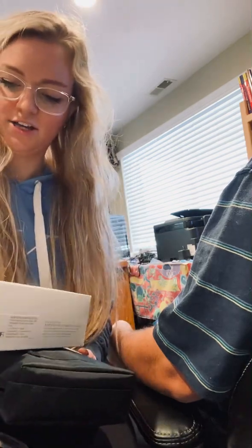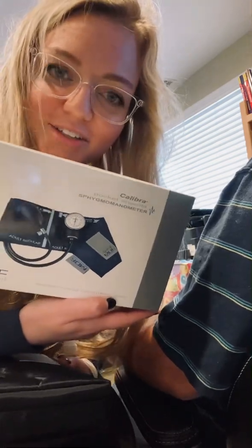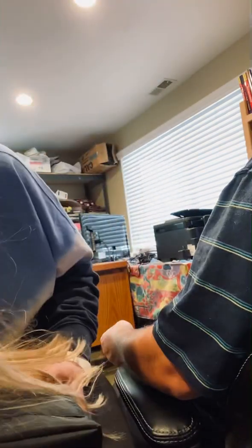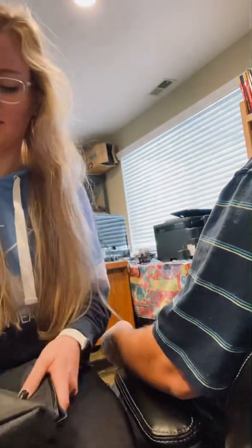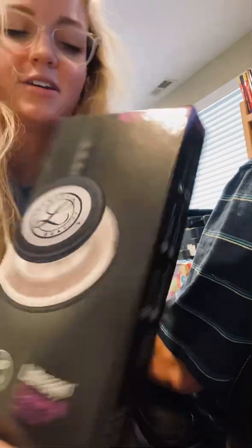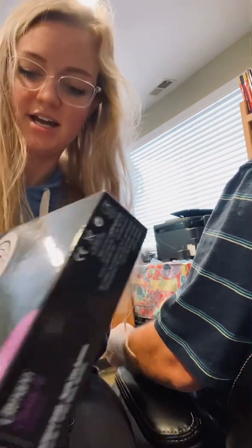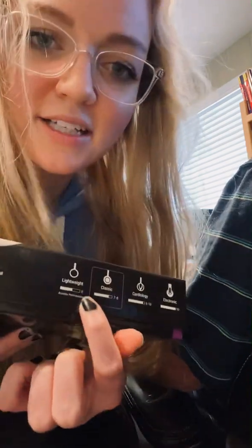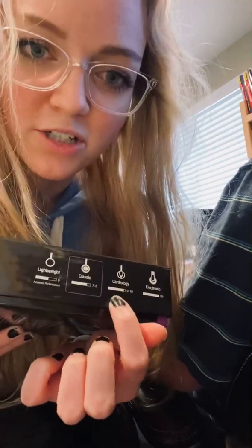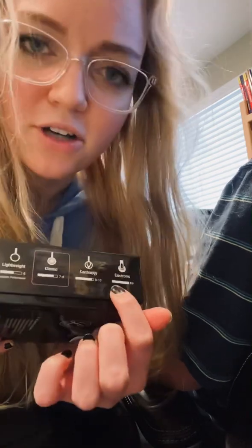So I use this — it's my sphygmomanometer. Try saying that three times fast. It just comes in this little case here, and then I've got my Littmann Classic 3 stethoscope. This one comes in a few different kinds: they've got the lightweight, the classic, they've got a cardiology one, which is good if you're a cardiac nurse, and then electronic. I'm not quite sure what that one is, but I like the classic one.